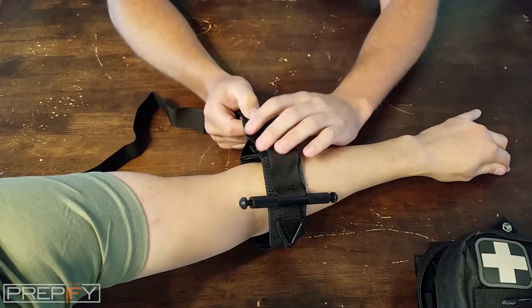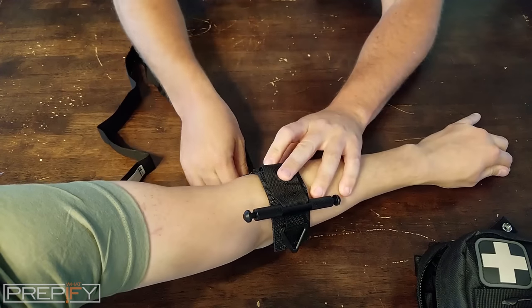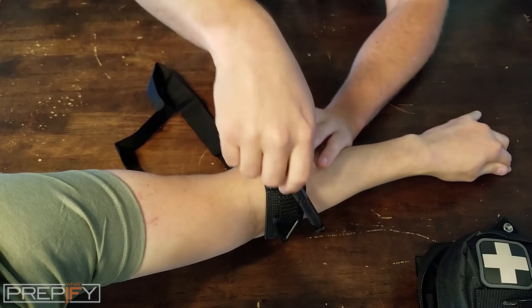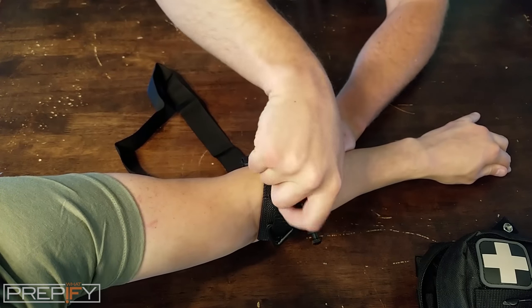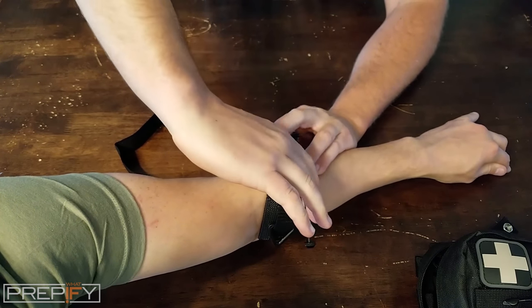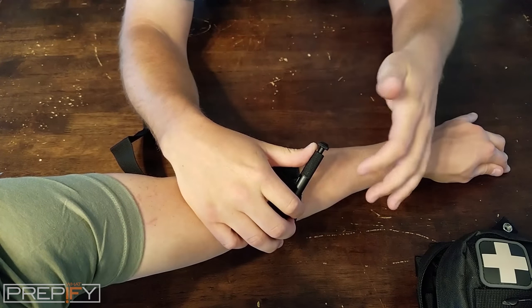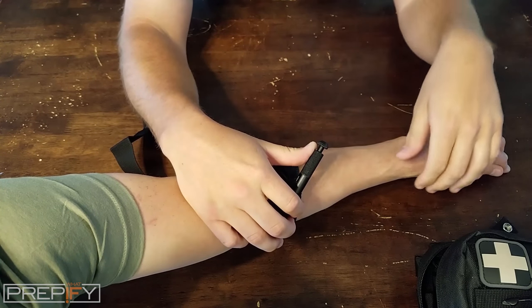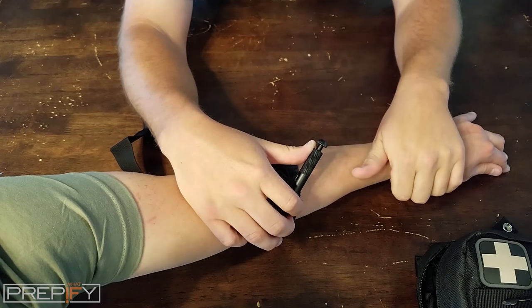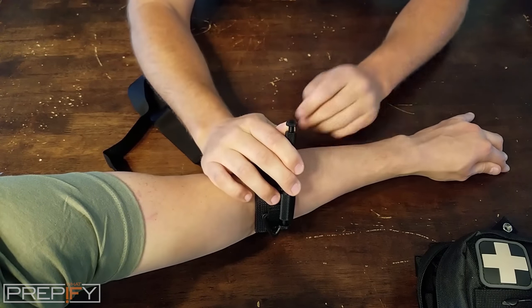Put it around the arm, tighten up the strap nice and snug, then start twisting the windlass — just like using a stick in the Boy Scouts, keep twisting it up. How tight do you go? If you have a bandage on and can't see the wound directly, reach down a little lower and check — it looks like we've already stopped the bleeding. I no longer feel the radial pulse, so we're good.